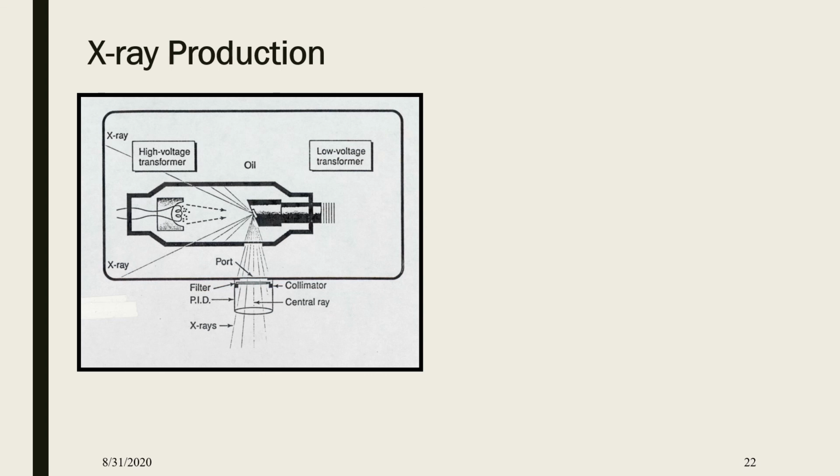Okay, so before we can start, of course, we must turn the machine on and set the control settings. We need to choose the correct patient size, and as we choose the correct patient size, the exposure time will automatically be changed as well. Our machines, as I've said, have preset milliamperage and kilovolt peak settings. Next, we need to press the exposure button and hold it down, and don't let go until you hear the beep and see the indicator light.